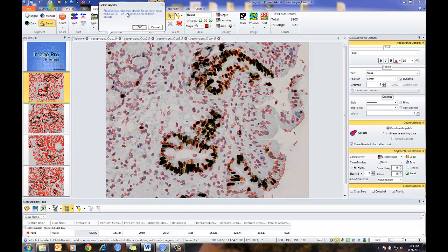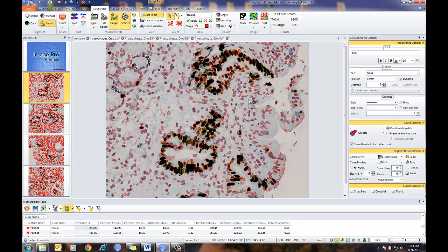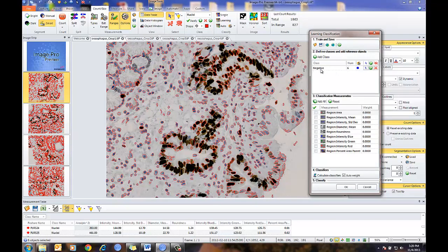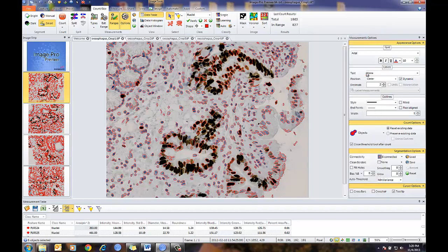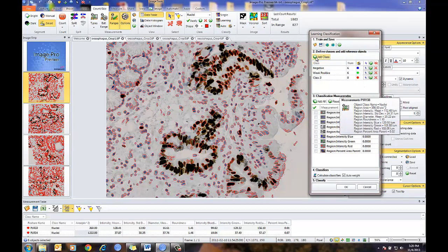I'm going to select one, then hold down the Control key and select other negative nuclei — picking them out of various structures. Press OK. You'll notice for that class it's called Negative and I have six objects. I can add another class — in this case I'm going to call it Weak Positive. Going back in and selecting, here I'm going to select some nuclei that have that mix of browns and blues. Then I'm going to create my third class and call it Positive.